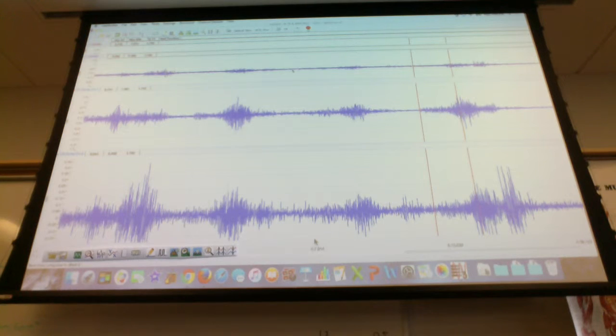And then the next set, did you guys go through the rules? Okay, so you found like this. This is the flexion, right? Flexion, extension, the three that they announce. Flexion, extension, and flexion. Okay. All right, so you guys did the whole thing.